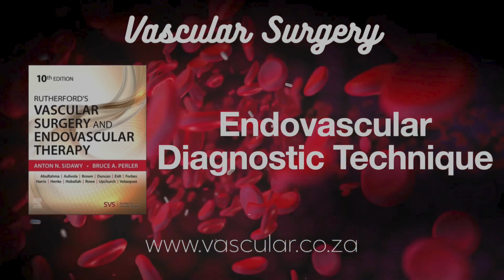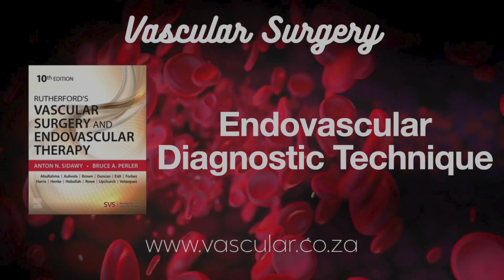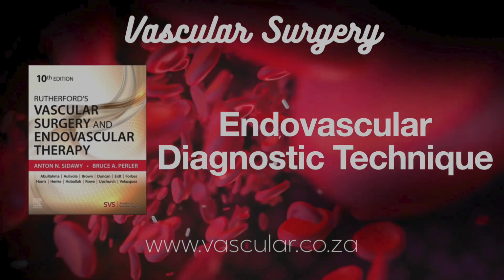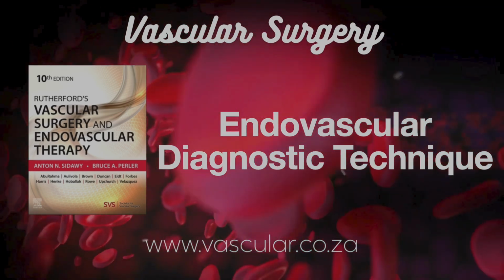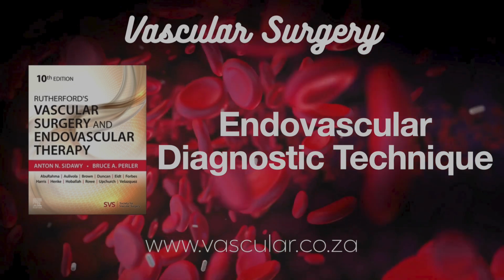How these tools are used for different areas. Seems like the approach varies a lot. It really does. Depends on the vessel size, the blood flow rate, the pathway you need to take, how sensitive the organ is that the vessel supplies. Lots of factors influence the choice of catheter and how you inject contrast.